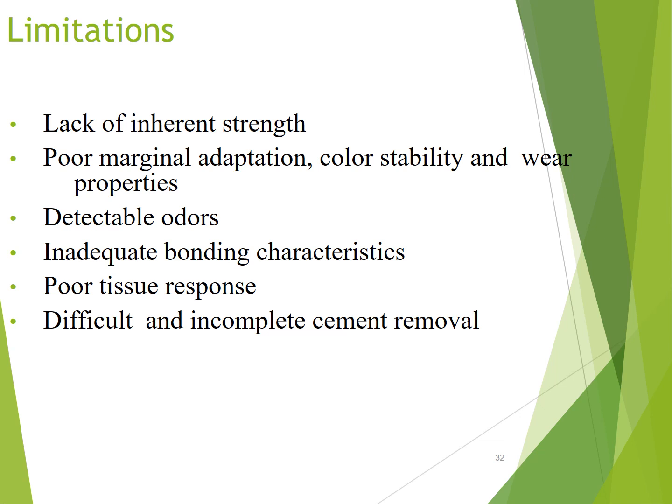So coming to the limitations, it has lack of inherent strength, poor marginal adaptation, color stability, and wear properties. It has a detectable odor. Also, it has inadequate bonding characteristics, poor tissue response, and difficult and incomplete cement removal.